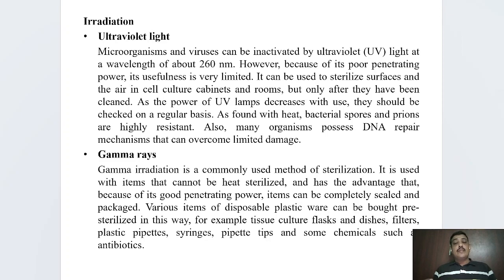In most cases, in a normal regular laboratory or cell culture laboratory setup, we won't be using gamma rays. We'll be using only ultraviolet rays, while gamma rays are frequently used in a company setup where they are producing an enormous amount of tissue culture consumables.